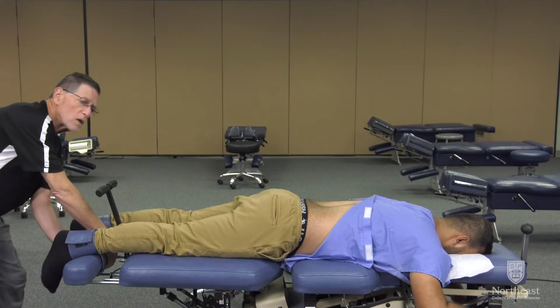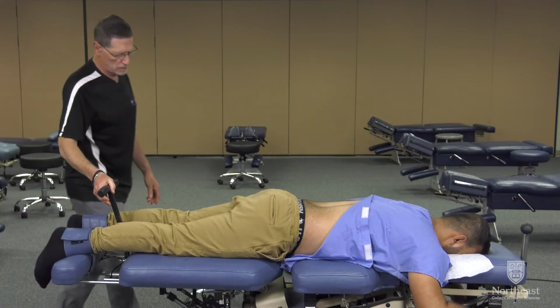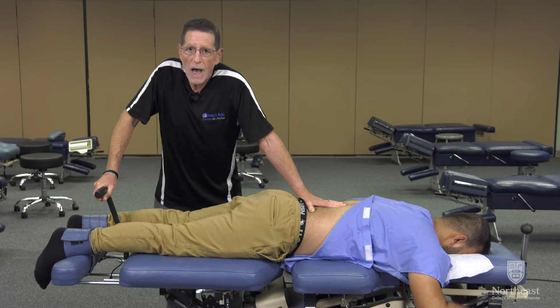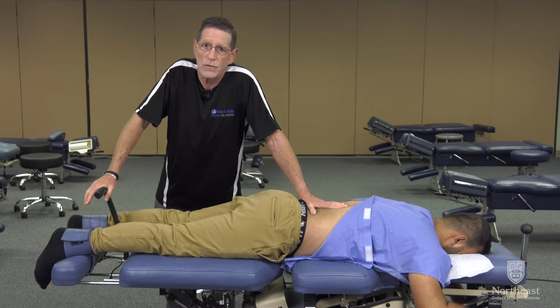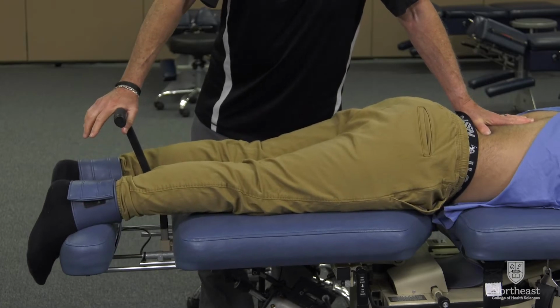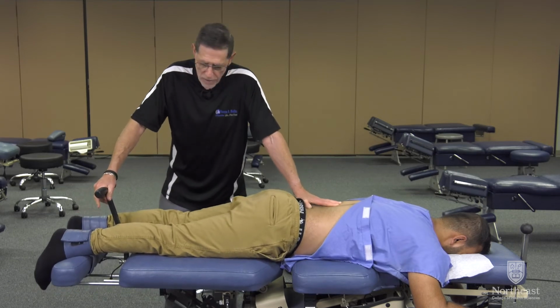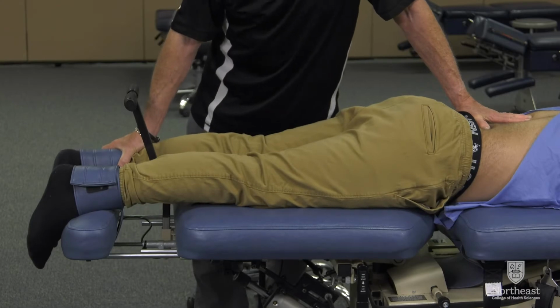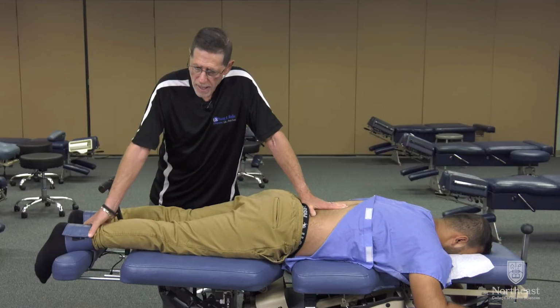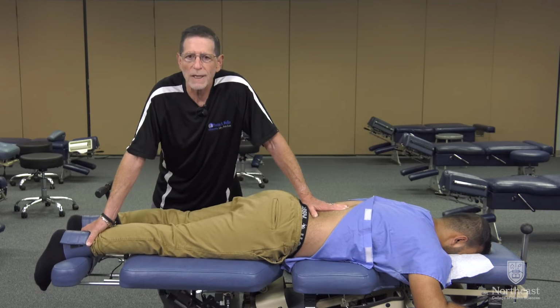And once applied, we traction the foot piece out to take out any slack in the ankles, knees, and hips and other tissue. The procedure is done again. We tolerance test with the cuffs on, especially when the patient is acute or has severe symptoms. And we make sure that there's no increase in the patient's symptoms going into the extremity. And then we test the legs individually as before, looking for any increase in symptoms along the way. And when this is tolerated completely, we can actually begin the protocol.